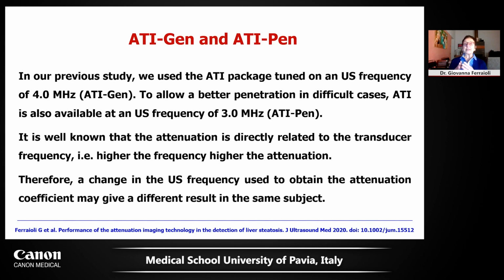It's well known that the attenuation is directly related to the transducer frequency. The higher the frequency, the higher the attenuation. Therefore, a change in ultrasound frequency used to obtain the attenuation coefficient may also give a different result in the same subject.